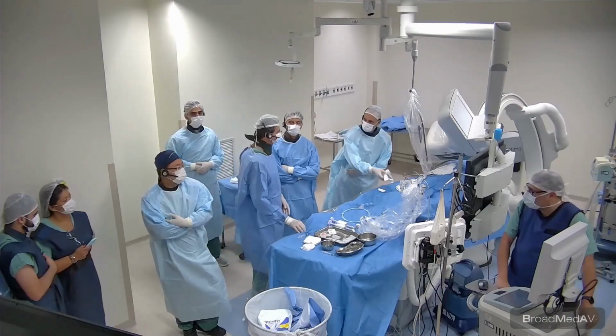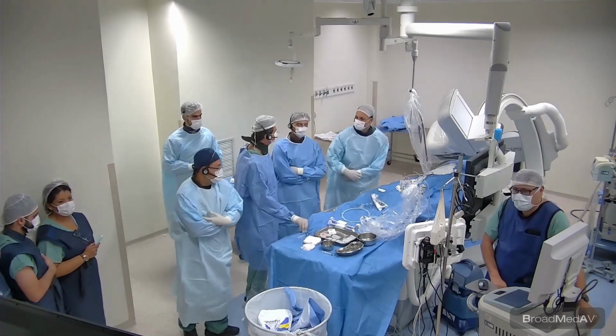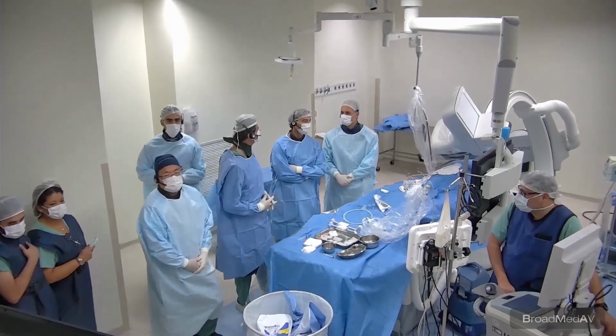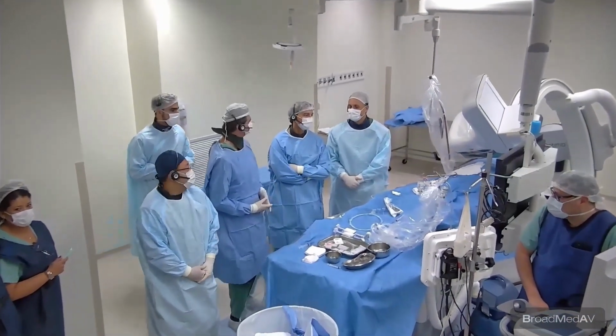So, great, Ricardo. And let me ask you a very simple question. Why is this patient here in the cath lab? Why is she not in the operating room? How did you decide it?